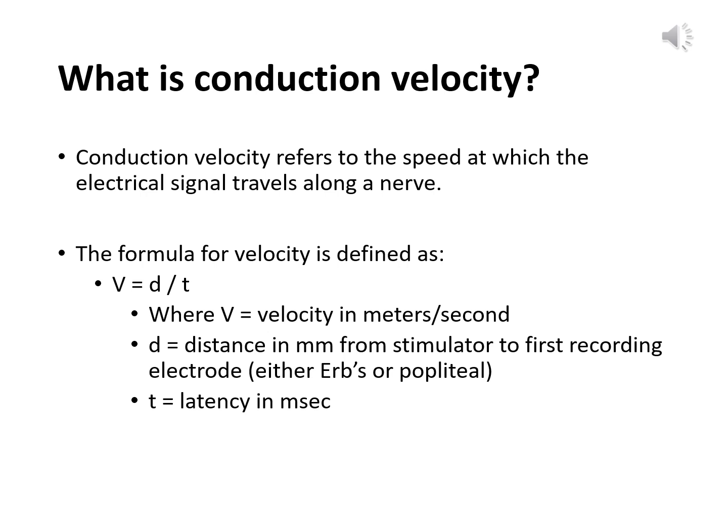If we have a measurement of the distance in either centimeters or meters, then we need to convert this into millimeters. Alternatively, we could use the distance in meters, but then we need to convert the latency, which is in milliseconds, to seconds, so that the answer again is in meters per second.